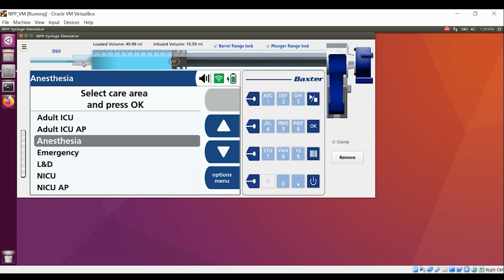2N3349. It is a microbore set, but because the inner diameter is a little wider, it should be able to handle a higher flow. The priming volume is a little higher. It's 2 mLs, but it's better to use a set with a little higher priming volume.